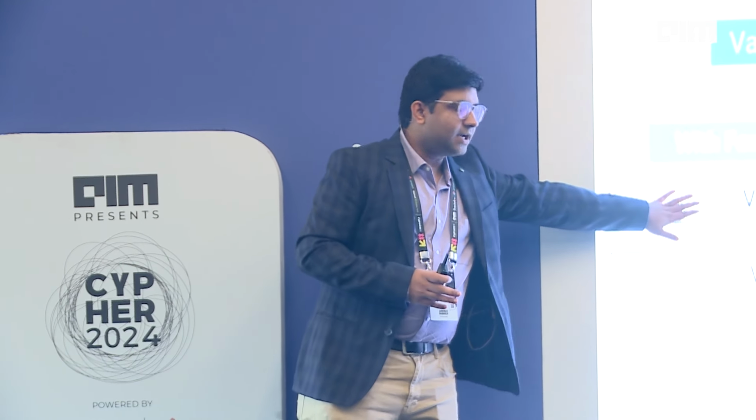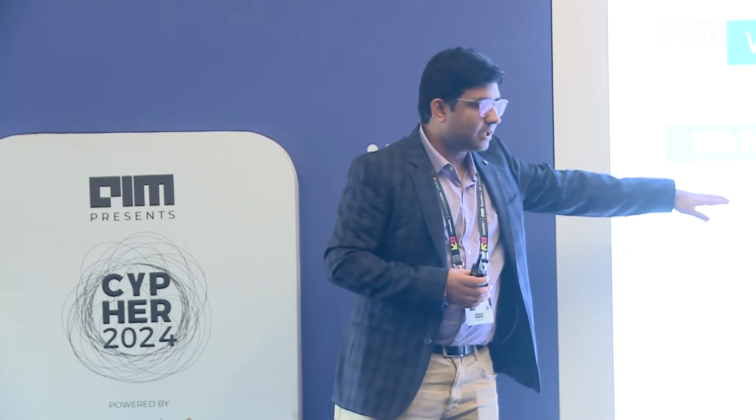If anyone is looking at, I'll move on. I'll explore over multiple architectures. So this foundation model training or foundation model design doesn't always work. It's not like this VIT-S is the only architecture that we can use. We can use multiple of these architectures. The average AUC, for example, if I reduce this size of the VIT from 12 depth to 6 depth, if you're getting confused on VIT, it's a very standard architecture. Later on, you can look at it on Google and you'll get why there's a 12 depth, what are number of heads, and so on. So if I reduce the depth with foundation model, the average AUC still holds.